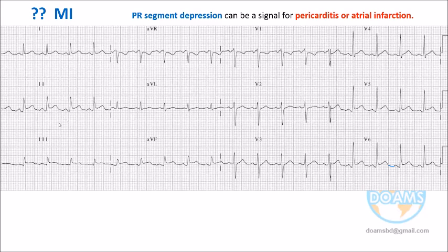It is satisfying this thing. Suppose if you can make it ST elevation, also very difficult to say. If you consider the same lead TP, if you can calculate that this is a little elevated, 1 millimeter, 2 millimeter, we are very curious to say this is an ST elevation. Even then, it is not coved up.